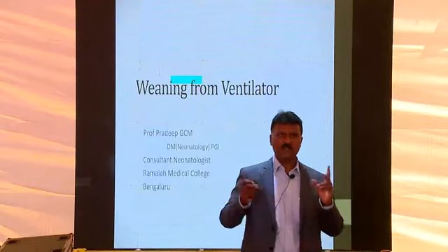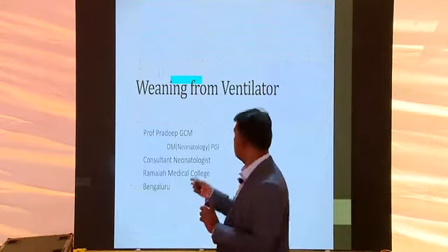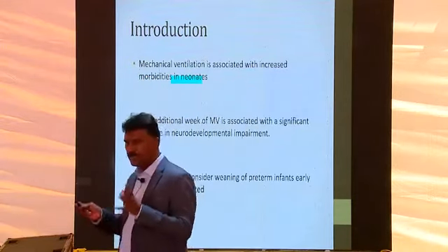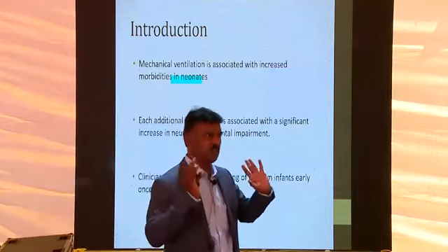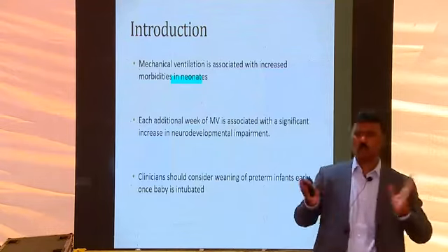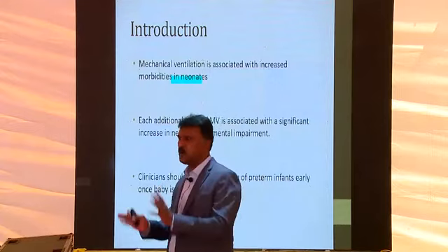The reason being, yes, ventilation comes at a cost. At least in our country, it comes with a major cost. One of your major worries is definitely the morbidities associated with invasive ventilation. So avoid invasive ventilation whenever possible. Try your level best with CPAP, HFNC, and whatever you want to do. Try your level best not to go on to a ventilator, because a ventilator always comes with a cost.